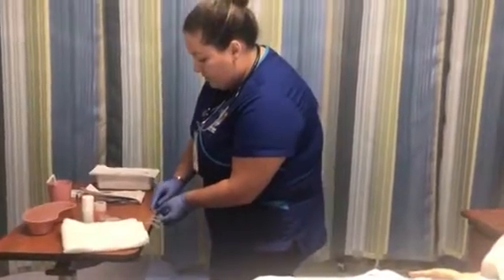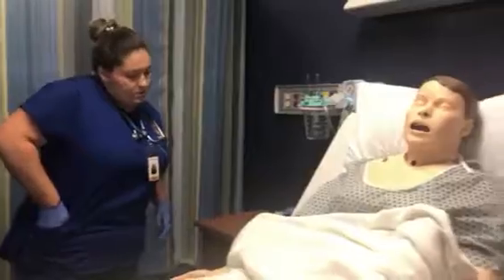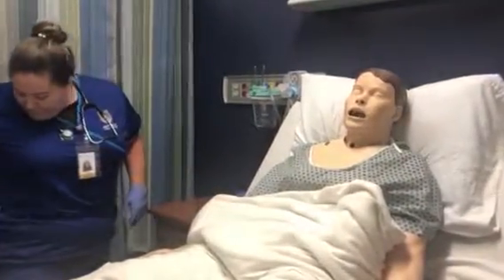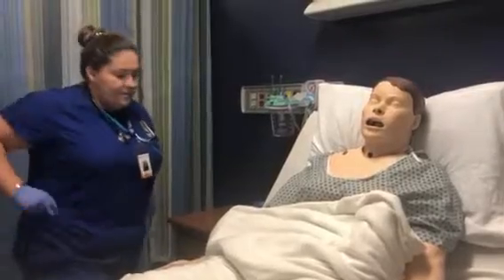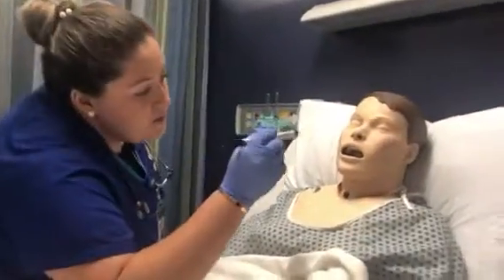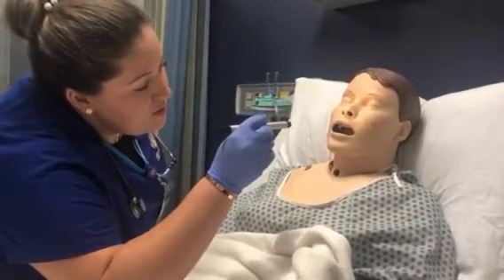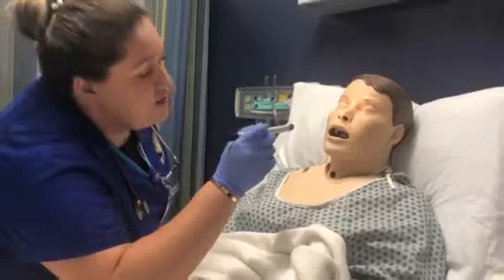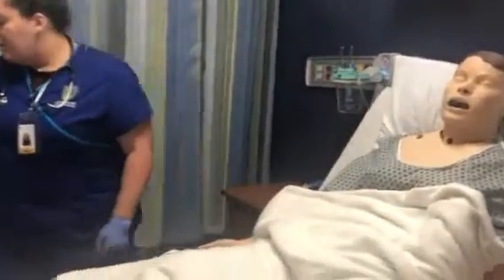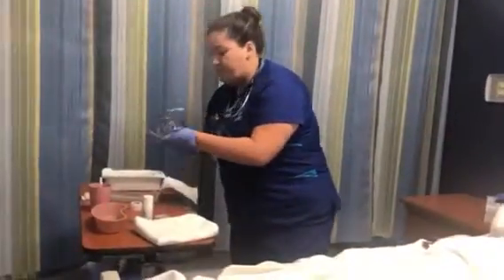Okay, before I begin, I just need to inspect. So I'm going to inspect the patient's nasal pathway. There seems to be no nasal polyps, no obstruction, no irritations, and no deviated septum. Okay. Next, take out the tube.